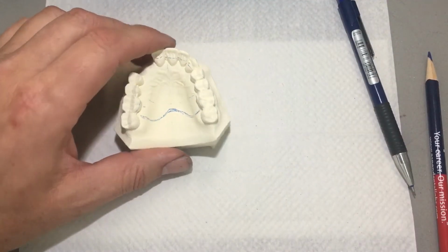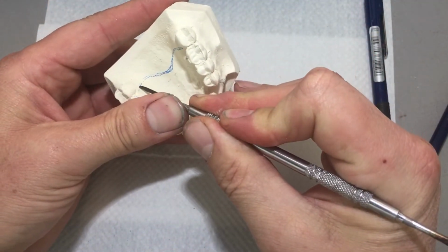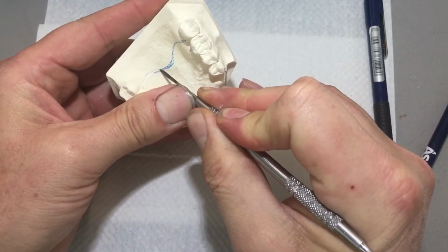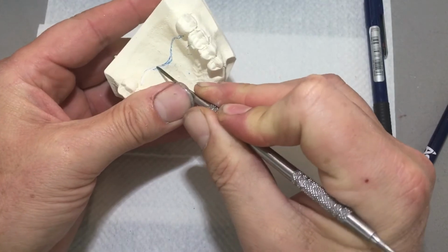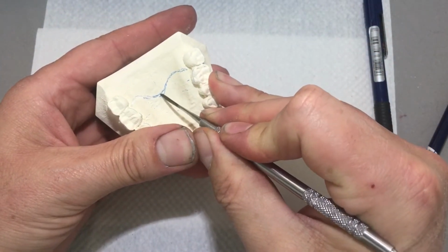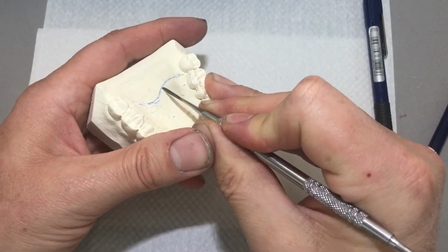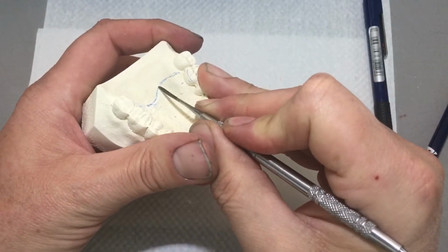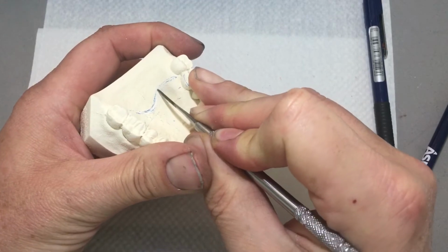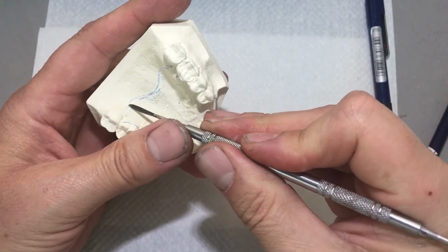Once I'm satisfied with my outline, then I'm going to go ahead and score the line. This line aids in trimming, also aids in slight shrinkage of the self-curing resin, because this is going to be a self-cure resin partial, or cold cure. So this aids in trimming and compensates for some of the shrinkage.